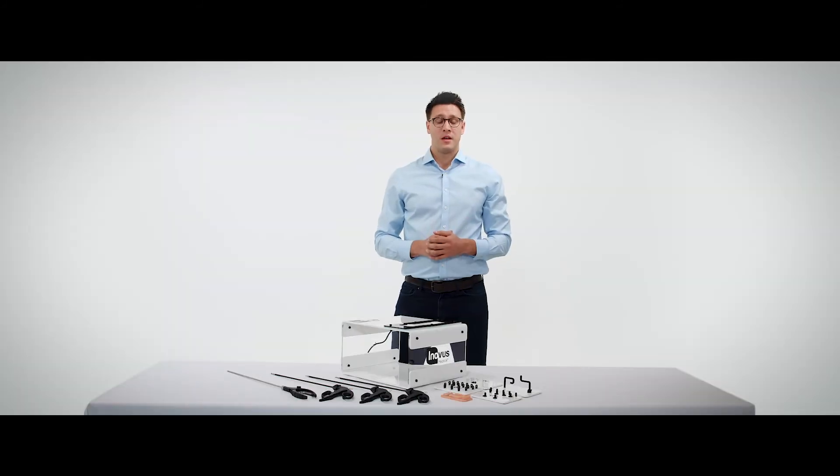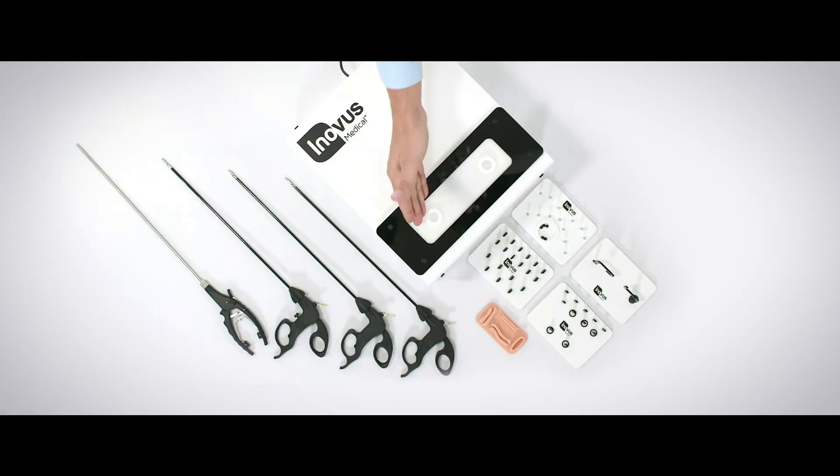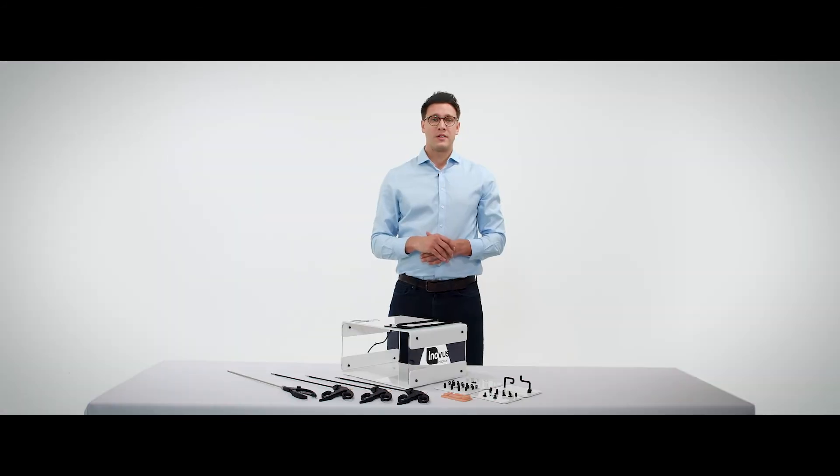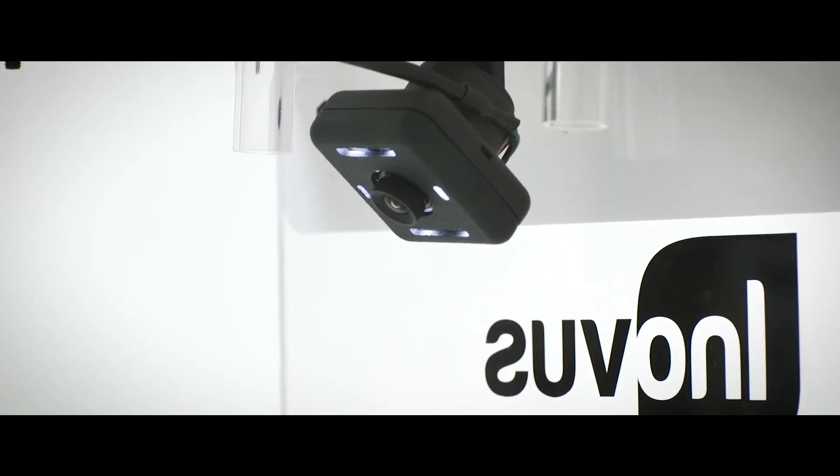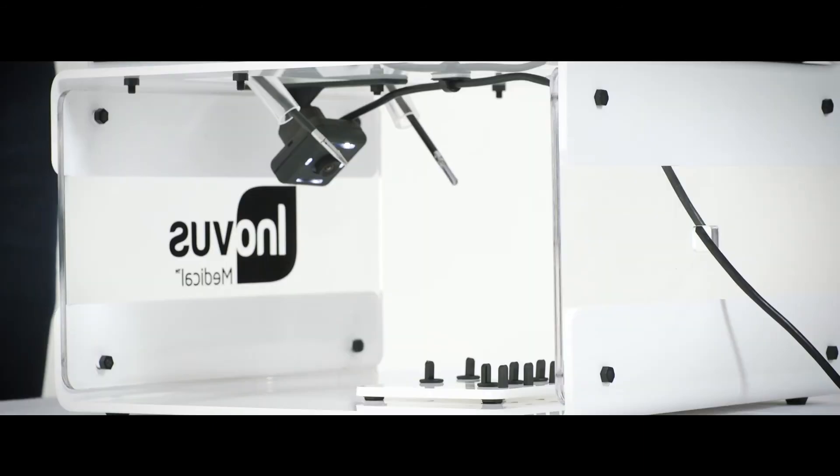Another unique feature of the simulator is the way in which we've positioned the laparoscopic ports. These are away from the camera itself, and as such when we are placing our instruments into the ports they do not create any camera shake during the procedure, and as such we end up with a rock steady view of the operative field.